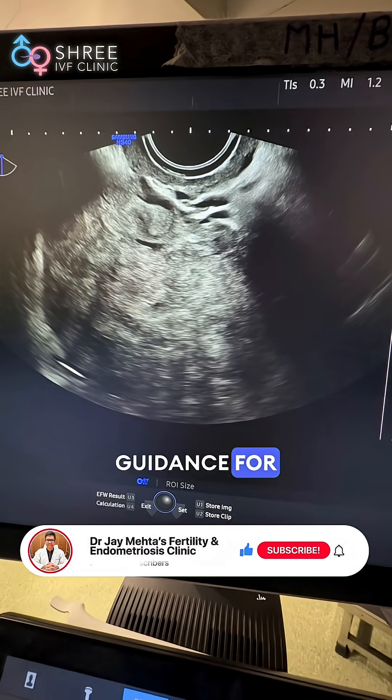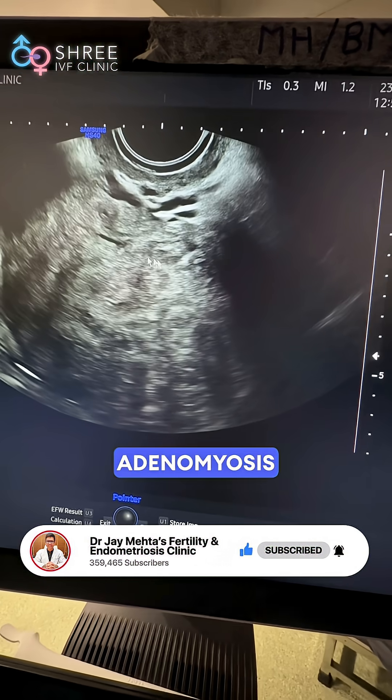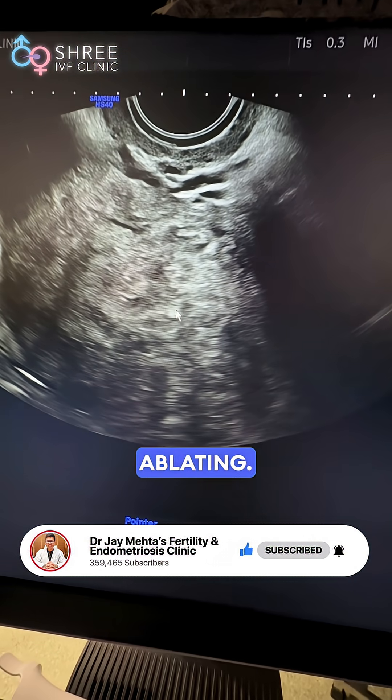Sonography guidance for such procedures is mandatory. You can see a large posterior wall adenomyosis which we will now be ablating.